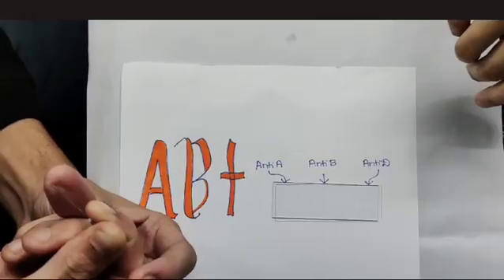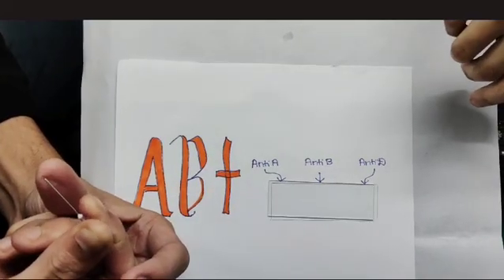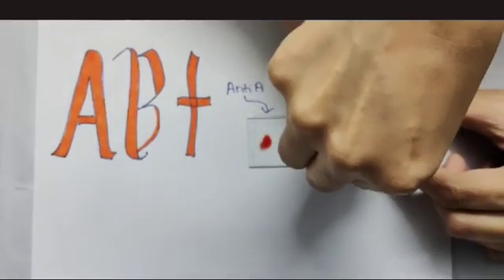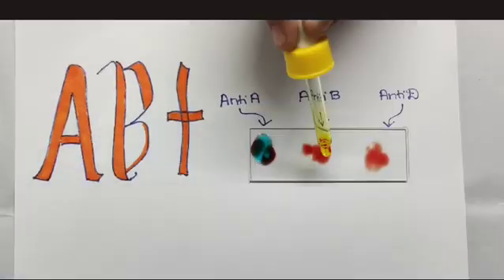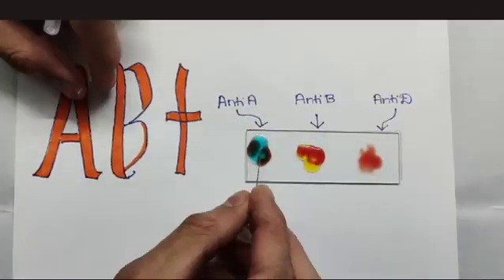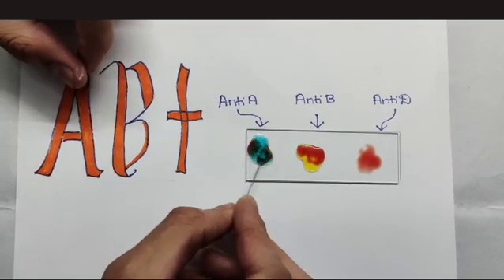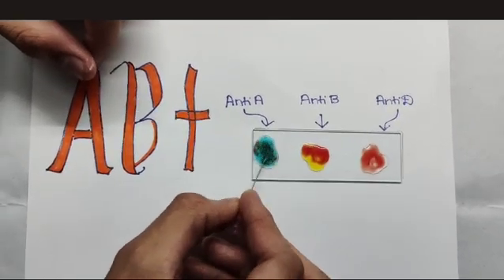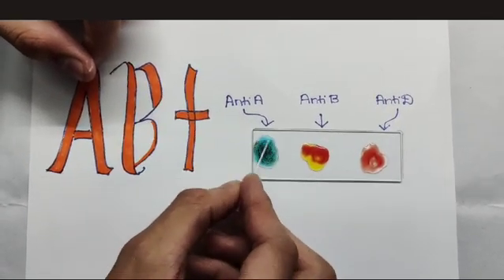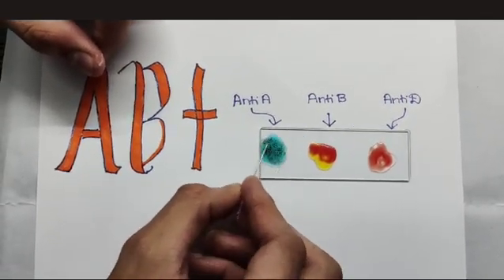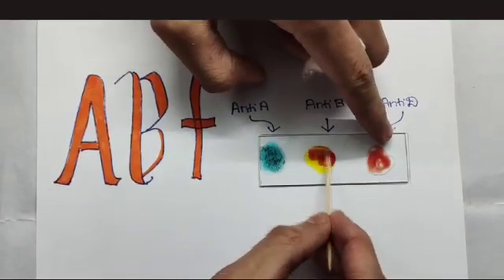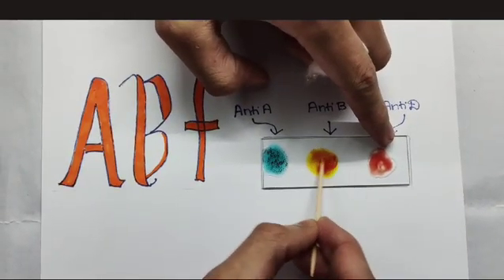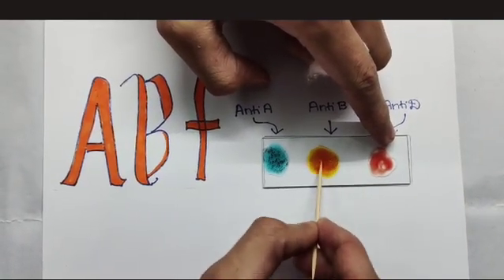For determining AB positive blood group, repeat the same procedure and observe. Here, clotting is seen in both anti-A and anti-B, which means both antigen A and antigen B are present. It is AB blood group.